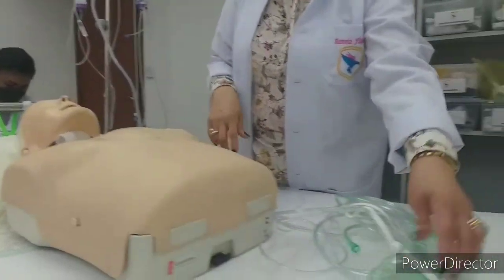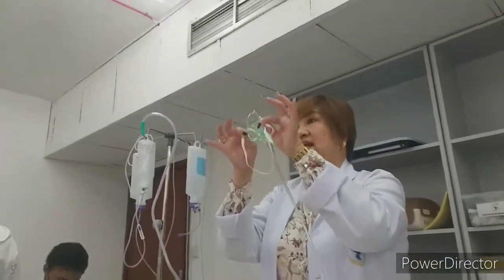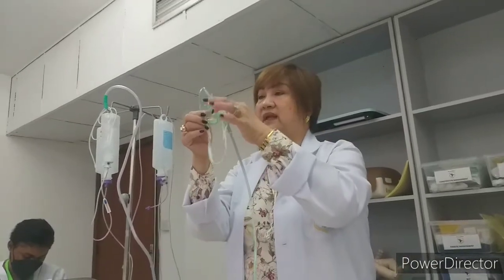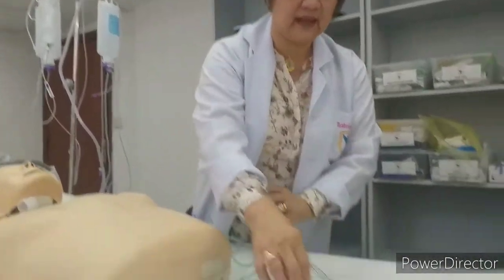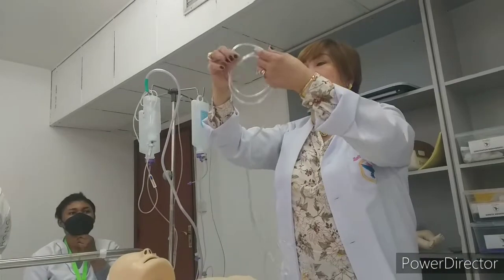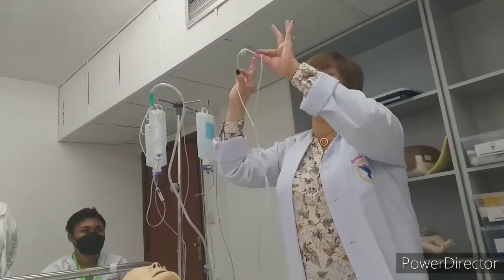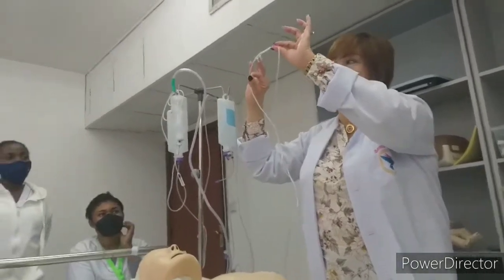Next, this one is for pediatrics. Okay? Normally for the baby, we will be using the nasal prong. This is pediatrics, but for the baby also, we can use it. This is the normal one. Now, we have the other type. We have the oxygen nasal cannula, or the nasal prong. Okay? P-R-O-N-G.